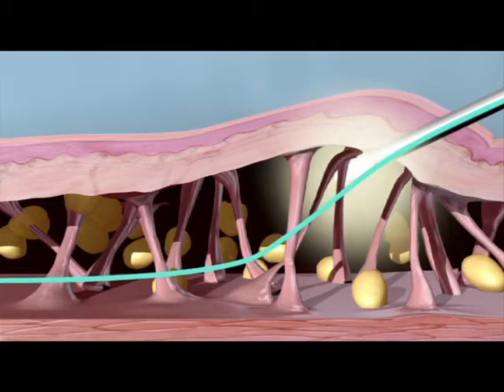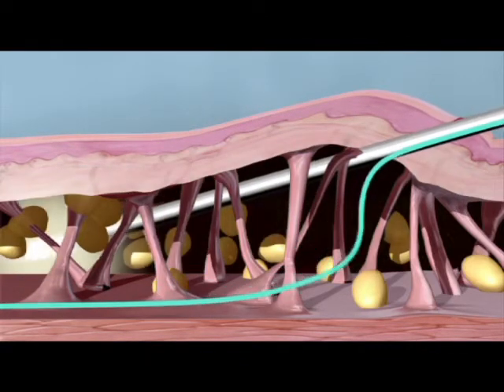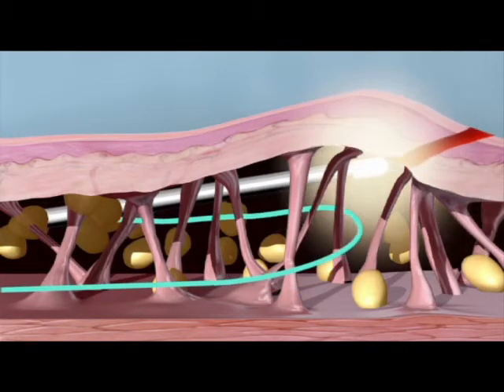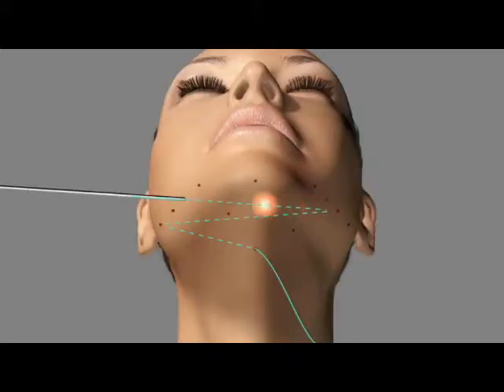When the procedure is used in a patient after a neck lift or other facelift procedure, or even liposuction of the neck, if there is no fat to be removed, only tunneling is performed prior to weaving in the suture matrix. Liposuction is only performed if fat is present.